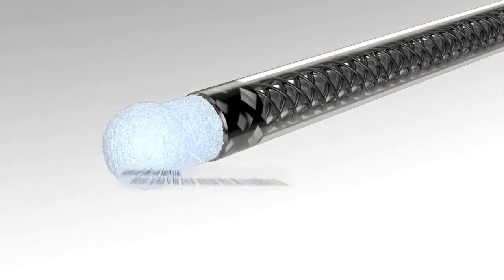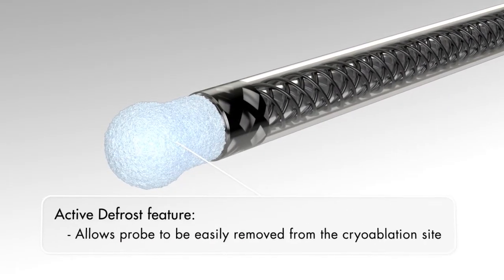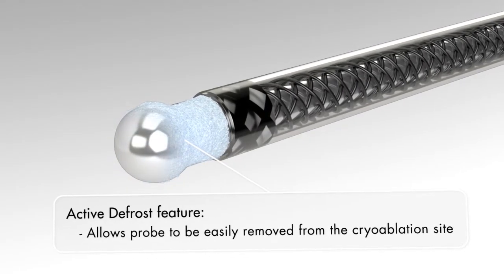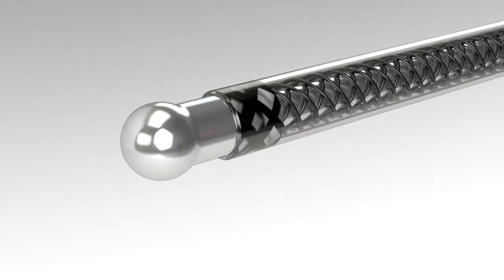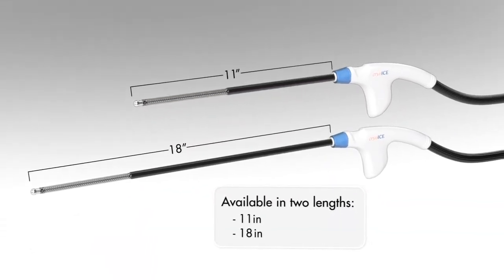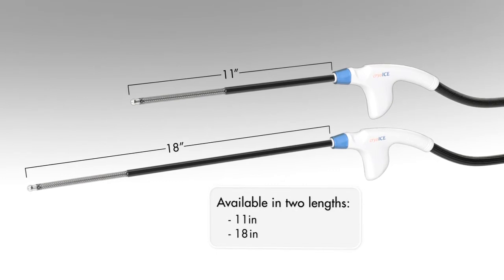The Cryo Ice family of probes includes an active defrost feature which allows the probe to be easily removed from the cryo ablation site. The Cryosphere probe is available in two lengths: 11 inches, in addition to an 18 inch version for applications where a longer probe is needed.